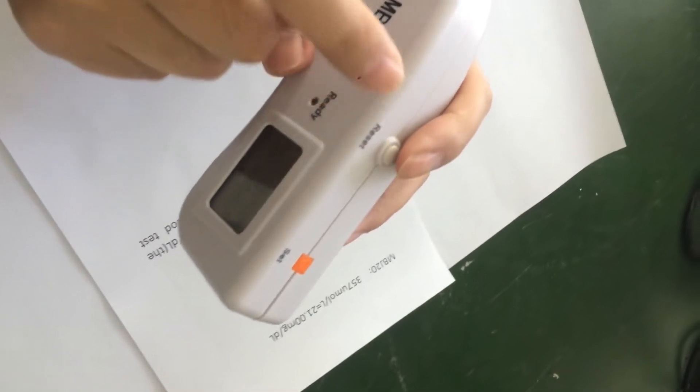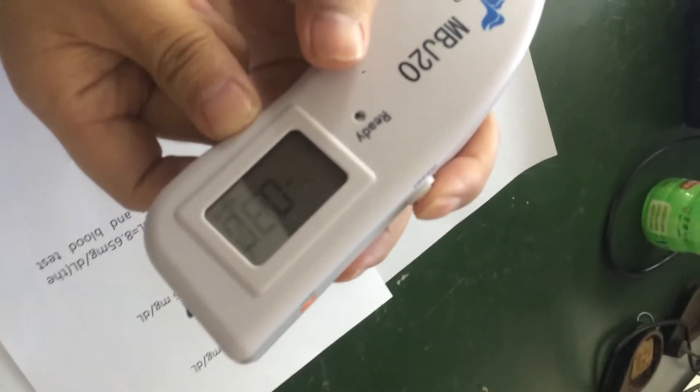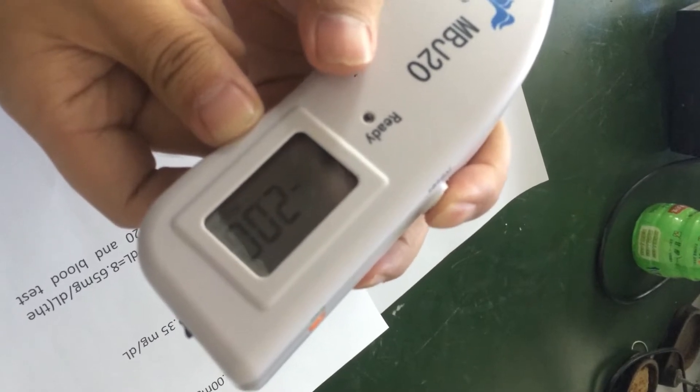Okay, reduce it. Press this button to reduce.